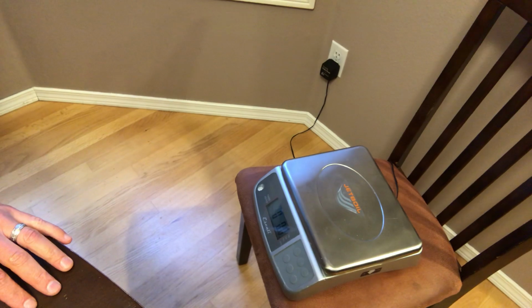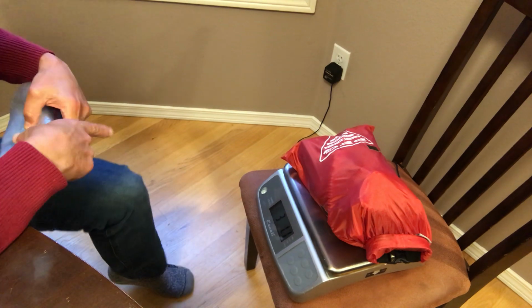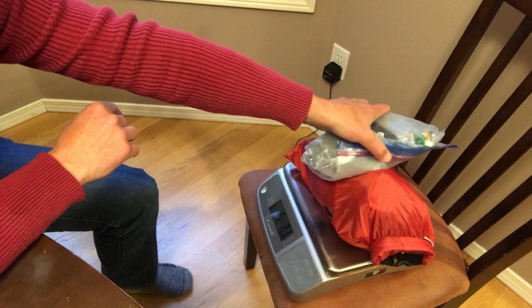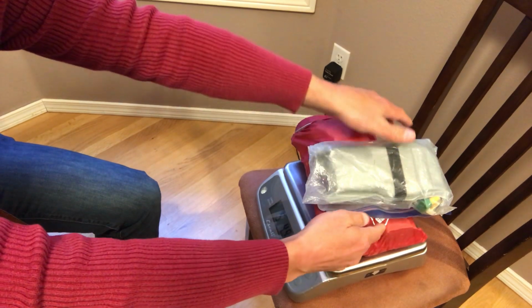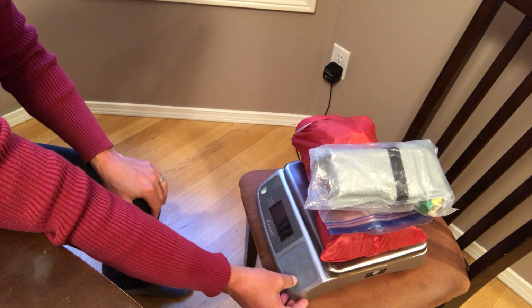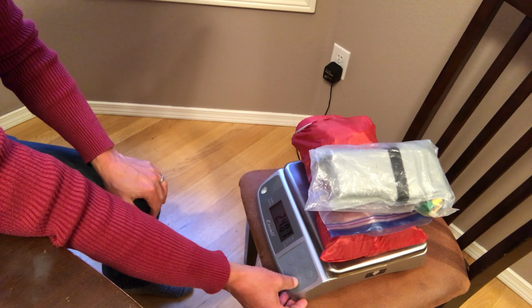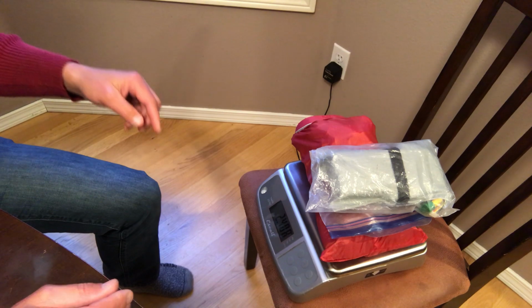And let's see how much this thing weighs. So that kit is 3 pounds 1 ounce. And if we get that battery on there, it's 5 pounds 5 ounces, which is 5.3 pounds. Or if you're into kilograms, 2.4. So it's like 5 1/4 pounds or 2.4 kilograms.